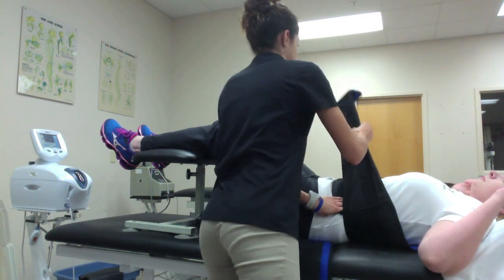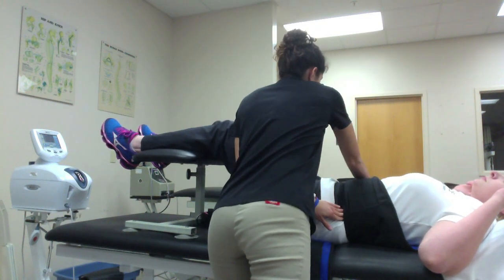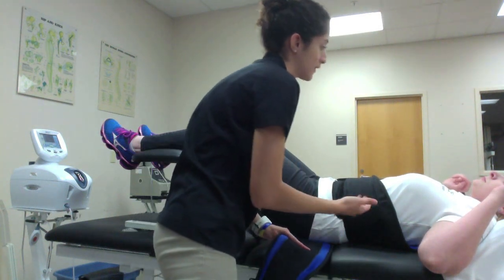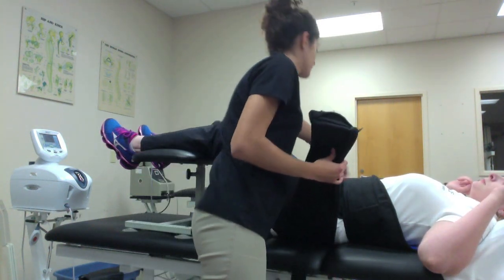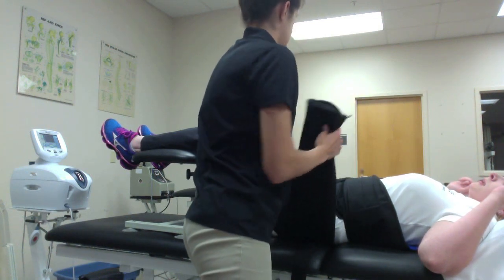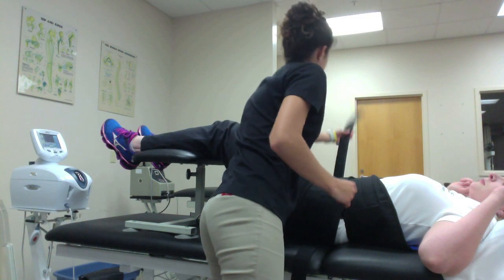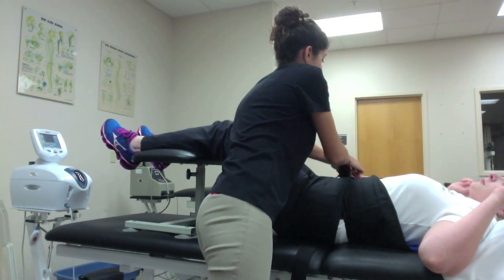I want to make sure these belts are nice and snug so that the patient also feels comfortable. Palpate the iliac crest and make sure the lumbar strap is encompassing it. Good so far with that. Now I can place the lumbar straps through. I can place these belts through the straps.